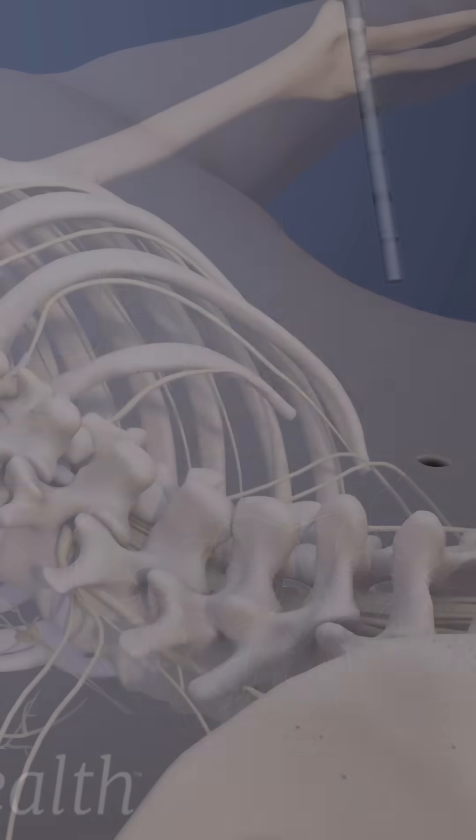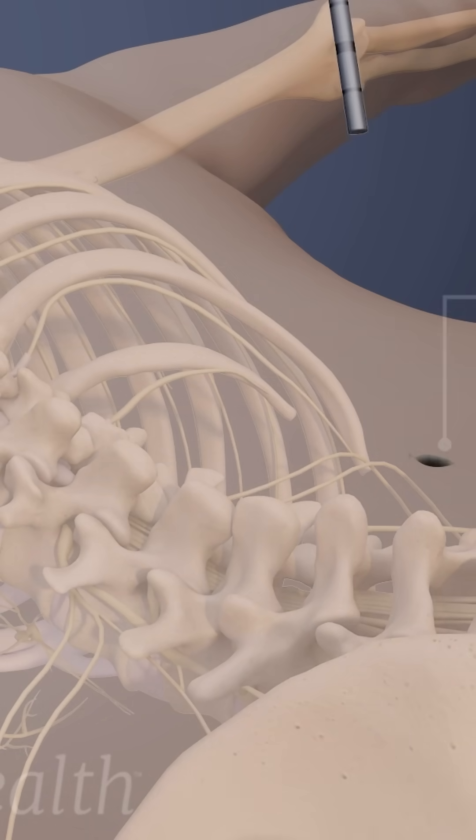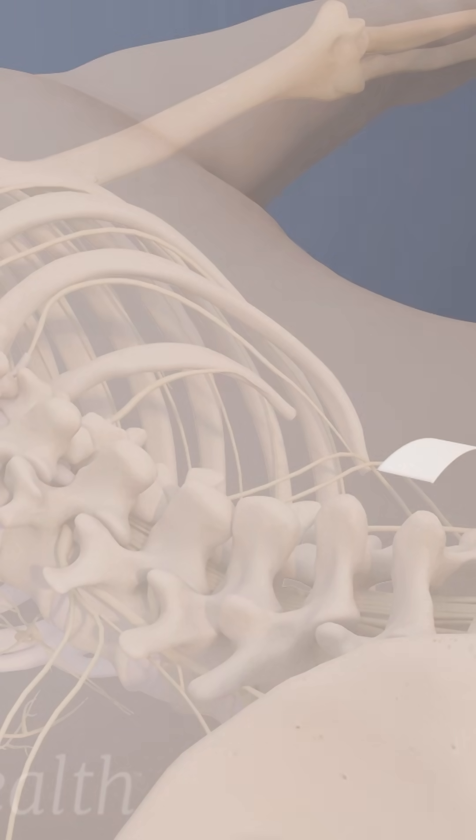The instruments are then removed and the incision is closed using dissolvable stitches or surgical glue. A small bandage is placed on the injection site and the patient is monitored for a short time before being discharged home.